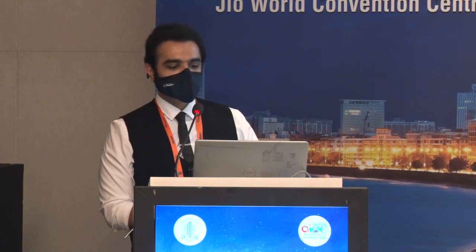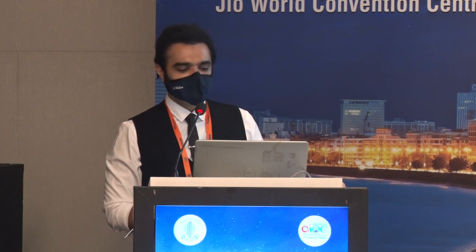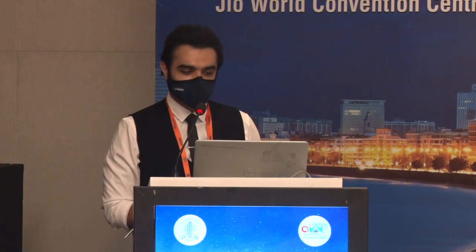The next thing is taking care of our trainees. It's been a real boon for trainees, and it has really shortened the learning curve. As you all know, with the side viewing of a microscope, you're limited to one or two trainees looking through it. But with the 3D system, no matter how many people are there, you can just wear cheap 3D glasses, look at the screen, and you're good to go. And it doesn't matter whether you're a fellow who's just joined or a senior fellow. From day one, you can see the depth perception. That way, you pick up things really quickly.